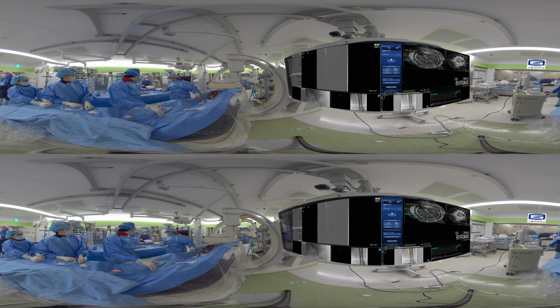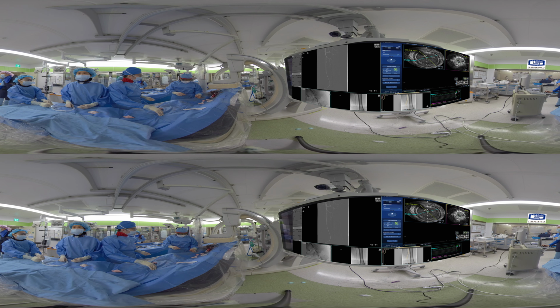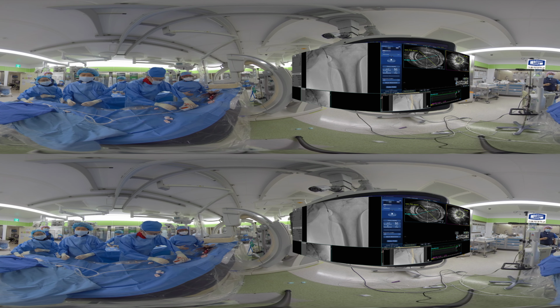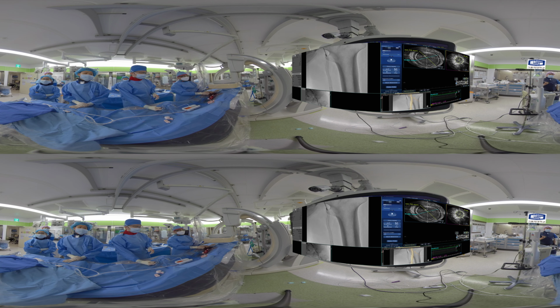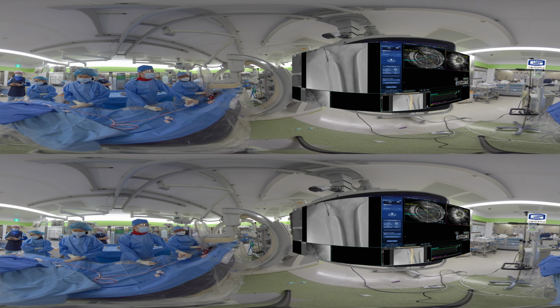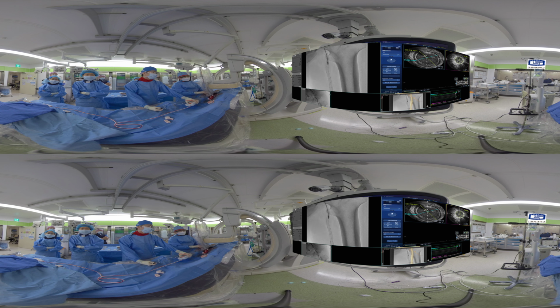We decided to use a large JETstream atherectomy catheter, which can cut 2.4 mm without blade and 3.4 mm with blade up. The JETstream atherectomy system consists of a catheter and control pod with a PV console. It has 2 catheters for SFA and 2 catheters for below-knee angioplasty.